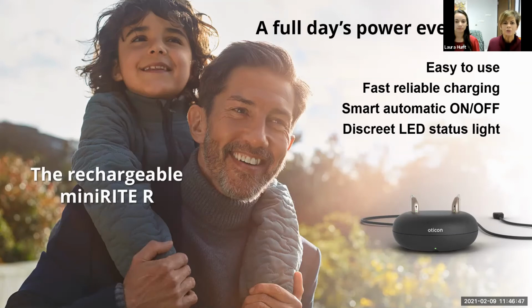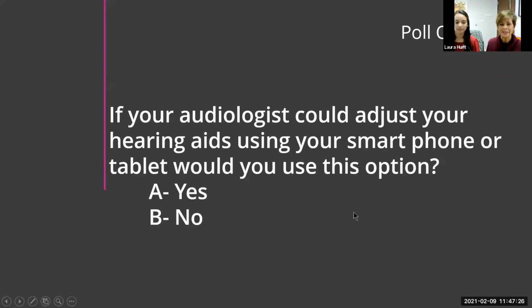The reason that it is rechargeable, which means you cannot put a battery into it, is because the chip, as Shalise was alluding to, has so much going on. It draws so much energy that it needs to be ramped up each day. If it was to use a conventional battery, you would be changing that battery about every other day because it just is doing so much behind the scenes. So I just want to encourage you that if you struggle with putting batteries in your hearing aids, the rechargeable system is the way to go moving forward. Had great success with them.